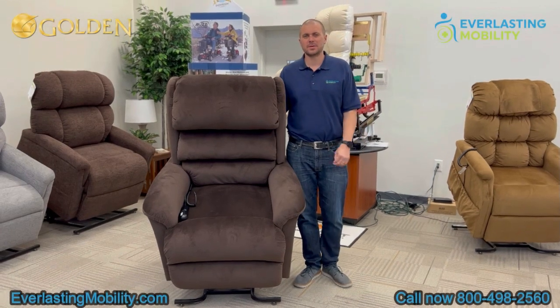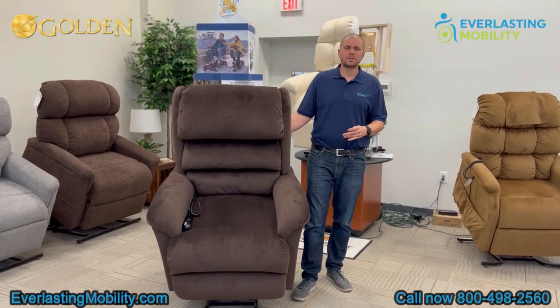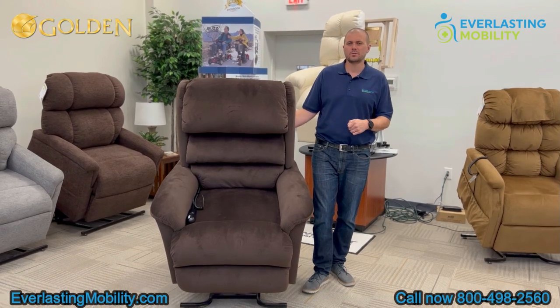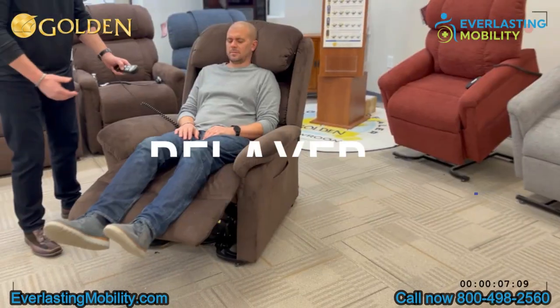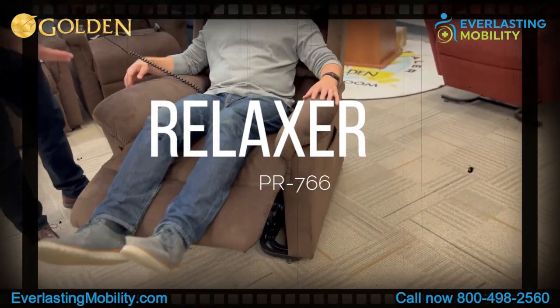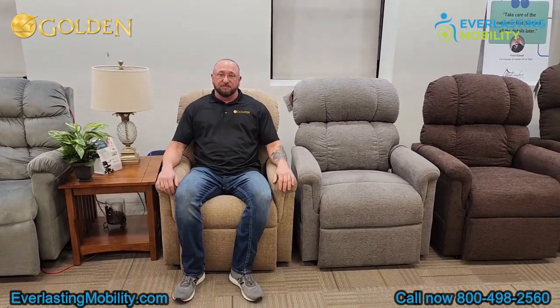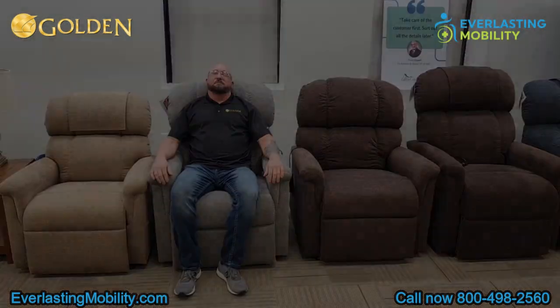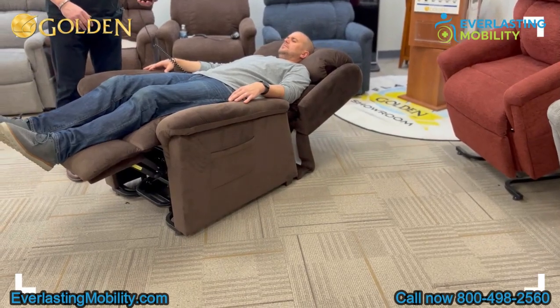Hi, this is Kel from EverlastingMobility.com. Today we're visiting Golden Technology's corporate headquarters in Old Forge, Pennsylvania. In this video, we're going to talk about the Relaxer, model number PR766. This chair comes in three sizes: small, medium, and large. It has maxi comfort technology, which allows you to get into the zero gravity position. So let's get into it.